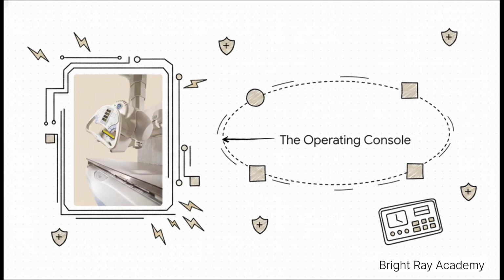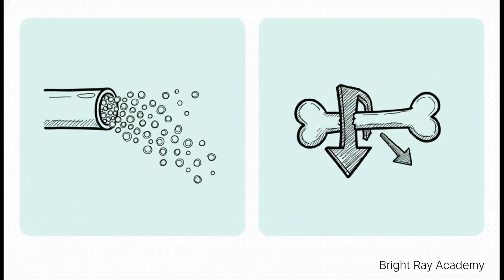Now, keep in mind, an X-ray tube operates at massively high voltages. We're talking kilovolts here, and obviously you do not want to be standing anywhere near those raw, dangerous power levels, right? That's exactly why all the electric circuits connecting to these meters and controls operate at a very low voltage. It's just a brilliant piece of engineering, specifically designed to minimize any possibility of a hazardous electrical shock while you're working. So, the really crucial thing to understand is what exactly you're adjusting from that safe, low-voltage cockpit.